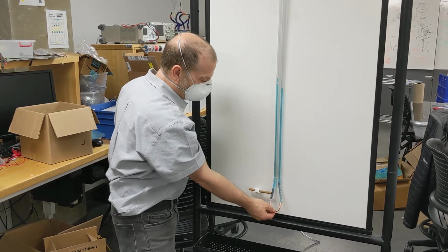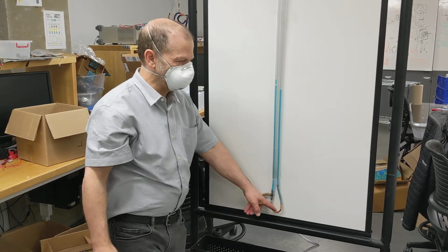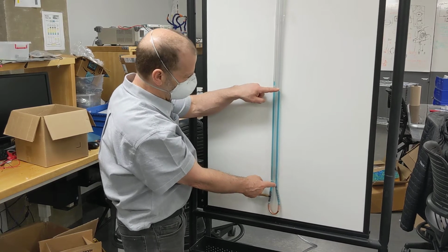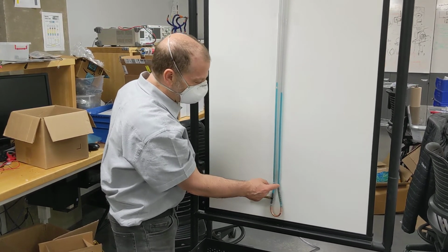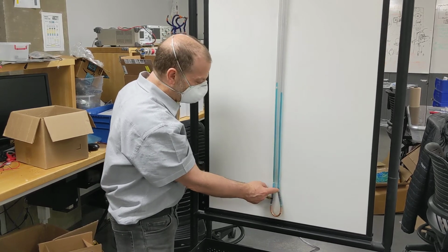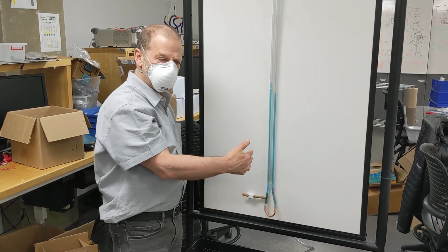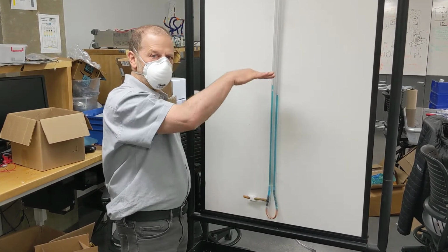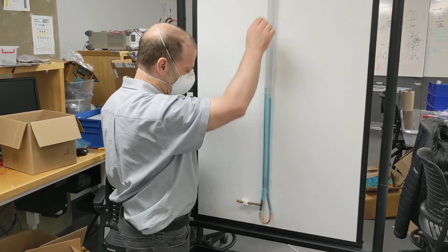And we're going to use that for an electrical connection too, because this is used for making the overpressure alarm through electrical conductivity through the lightly salted water to one of these arms. Then there's a piece of silicone tube in which I've put some stainless steel scrubber stuff in order to slow down the motion of the water so that it doesn't bounce. You know, it settles to a new level quickly without bouncing. And that's about it. That's the whole construction.